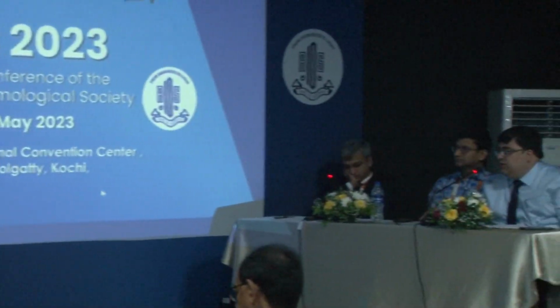Thank you, Dr. Ajay. I would like to know what is your reason for using this particular technique, what are the advantages that you find? So one advantage which I find is that the maneuverability is easy. We are maneuvering the IOL outside the eye, not inside the vitreous cavity. Beginning surgeons can have problems maneuvering the lens inside the mid-vitreous cavity. In this technique the lens is outside, and we're just maneuvering it from outside only.